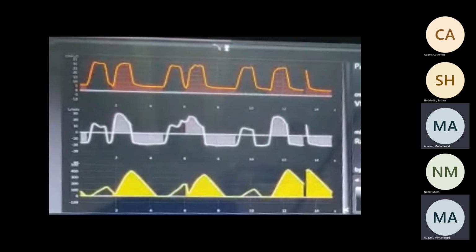So if I get to change something in this patient, I will ask why the machine is having an early trigger. The machine triggers before the patient starts the breath. Whenever the machine triggers, then the patient decides to have a PMUS. So there are two options. The easy physician's option: take off the PMUS and paralyze the patient. You will see a beautiful picture, but a bad patient.